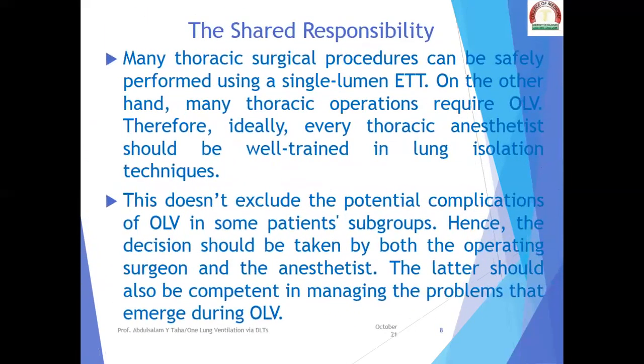The shared responsibility. Many thoracic surgical procedures can be safely performed using a single lumen endotracheal tube. On the other hand, many thoracic operations require one lung ventilation. Therefore, ideally, every thoracic anesthetist should be well trained in lung isolation techniques.